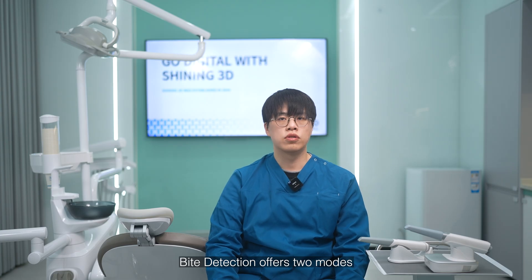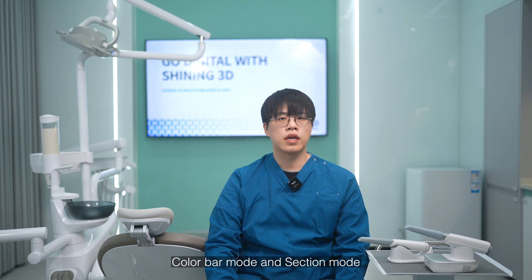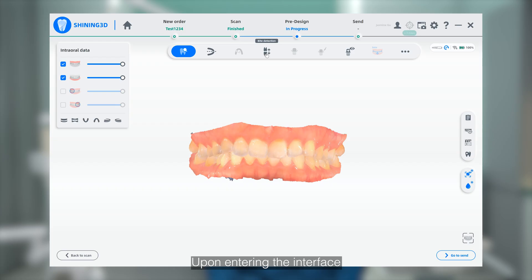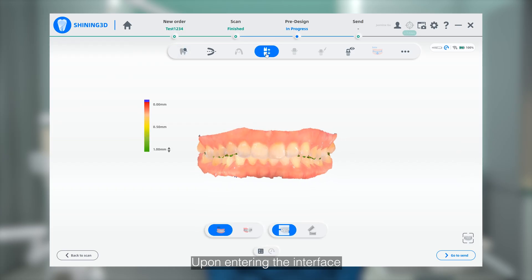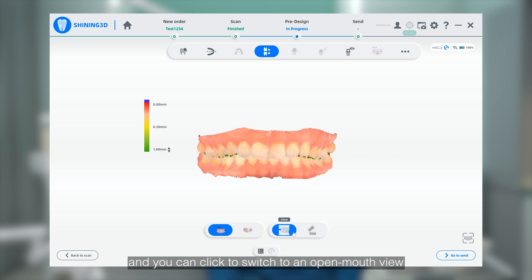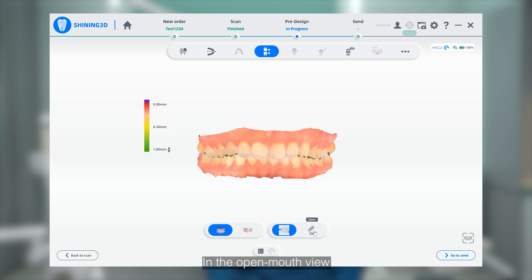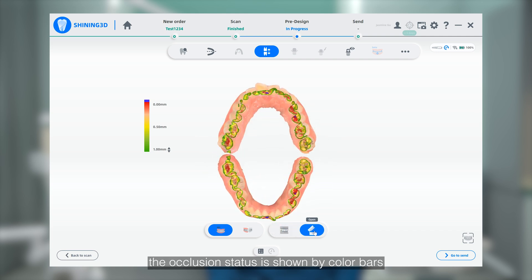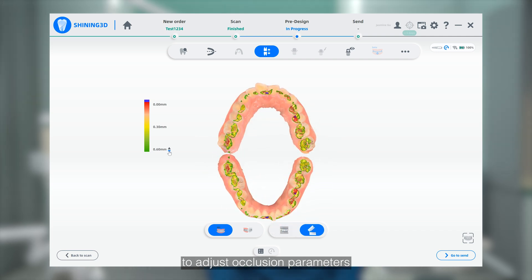Bite detection offers two modes: color bar mode and section mode. Upon entering the interface, the default view is closed mouth for dual view in the color bar mode, and you can click to switch to an open mouth view. In the open mouth view, the occlusion status is shown by color bars. Click the arrows on the left to adjust the occlusion parameters.